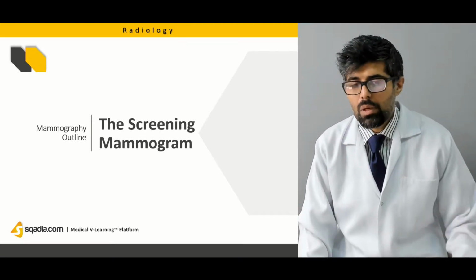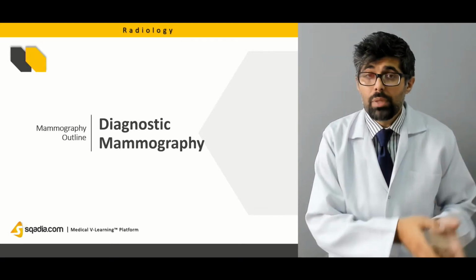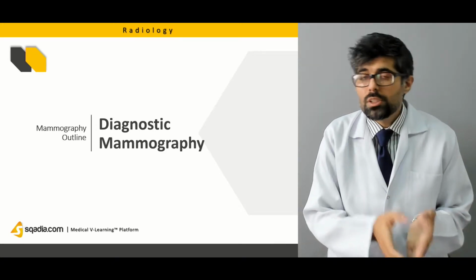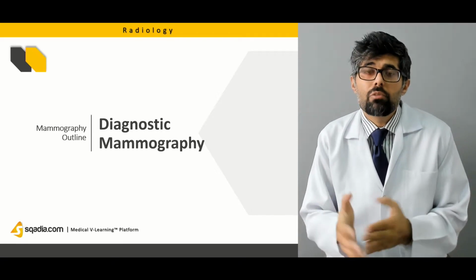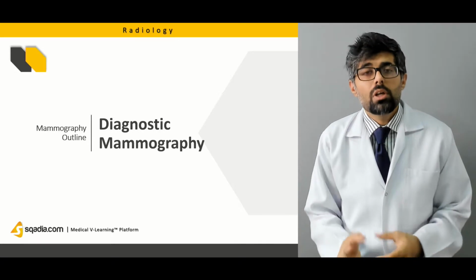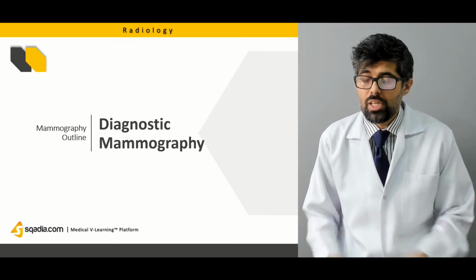Then the screening mammogram, as we already talked about. Then we'll learn about the diagnostic one, that if it is benign, what kind it is, what makes the adipose different from a fibroadenoma, what causes the false negative mammograms, what is a cyst, how is a cyst different from a developing density, or if there is no density or mass, then what does dimpling on the skin signify. We'll learn it all in the diagnostic mammography, and we'll also learn about the classification system, the BI-RADS classification system.